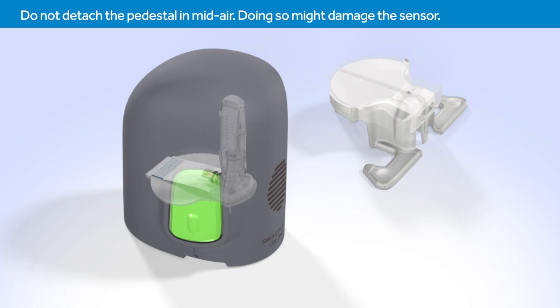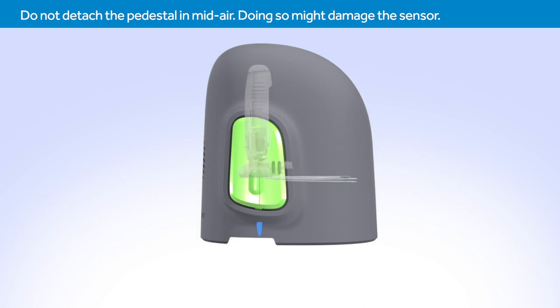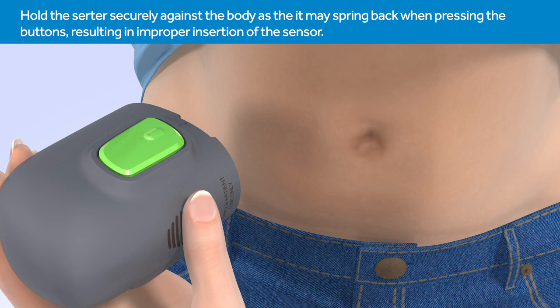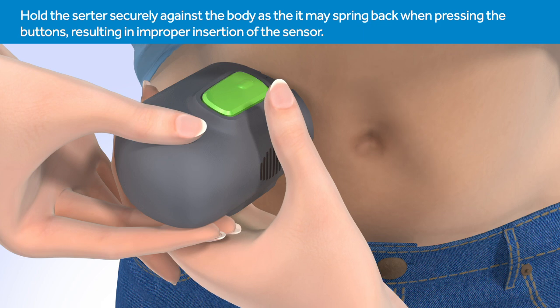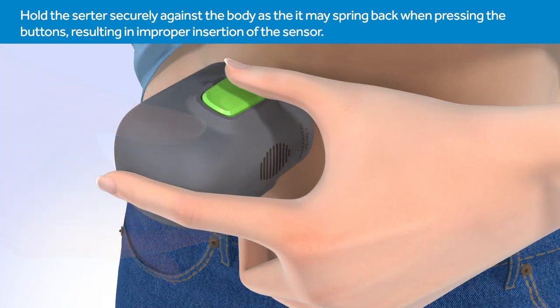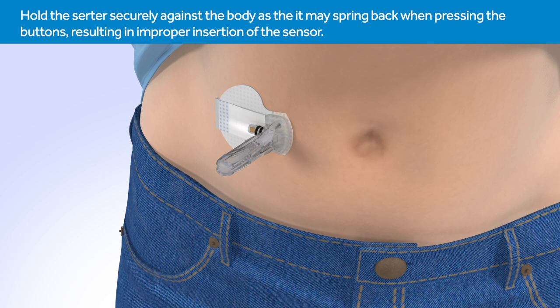This step also removes the adhesive liner from the sensor. The side arrow on the Serter will indicate where the needle is located. Place the base of the Serter flat against the site that you prepared. Holding the Serter securely, press and release the small bumps on both green buttons at the same time to insert the sensor. Do not pull the Serter away from your skin yet. Continue to hold the Serter against your skin to allow time for the adhesive to stick, then slowly pull the Serter away from your skin, making sure you do not press the buttons while doing so.